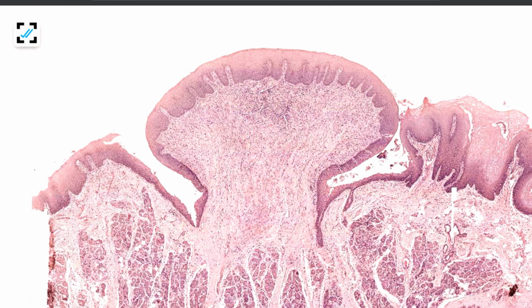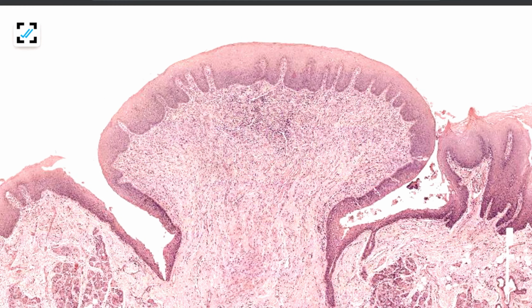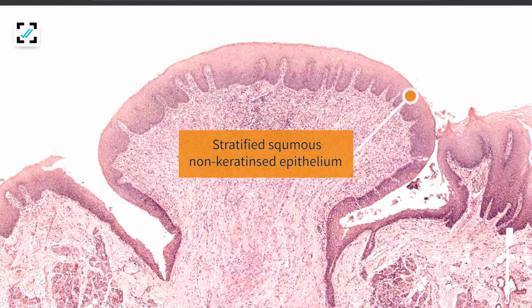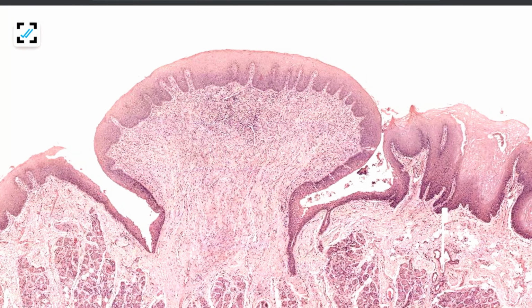The structure of circumvallate papilla can be compared to a castle which is surrounded by a moat filled with water. If we enlarge the view in coronal section, these papilla appear mushroom shaped with a narrow base and a broad apex. As we can see, the circumvallate papilla are covered by stratified squamous non-keratinized epithelium. Peculiarity of these papilla are their wall contain numerous taste buds. Close to the vallum, we have plenty of small serous glands referred to as von Ebner's glands, which open into the base of the sulcus.